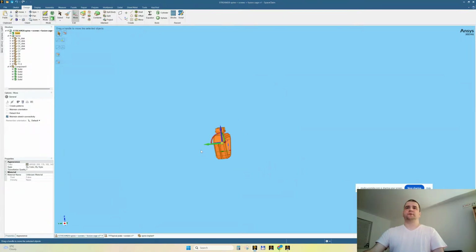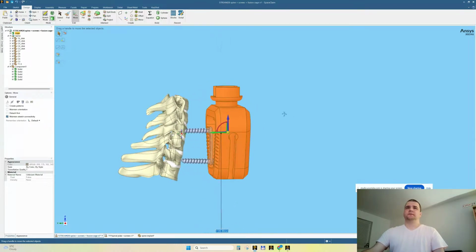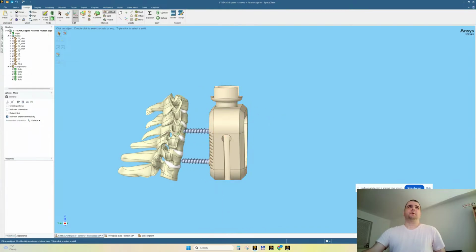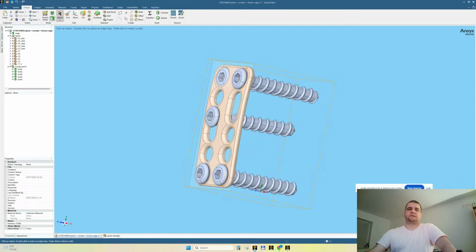Of course, as always, it is thrown in the universe. Let's call it cage. Maybe I should have named it Nicholas. And let's move it here. I think I'm not the only person who named this part Nicholas. So let's save, of course. Can I close the other parts? Let's close them.